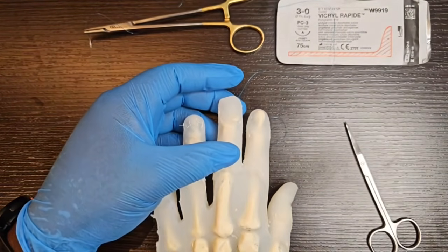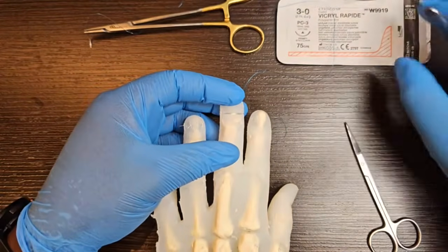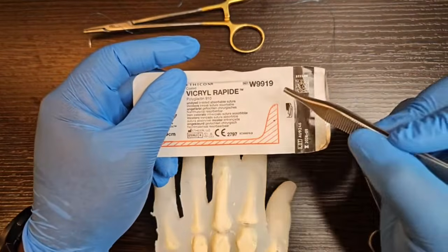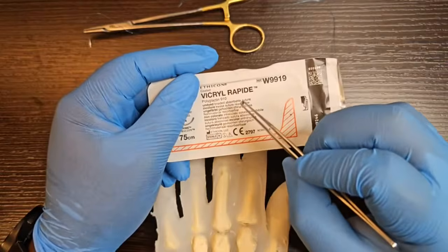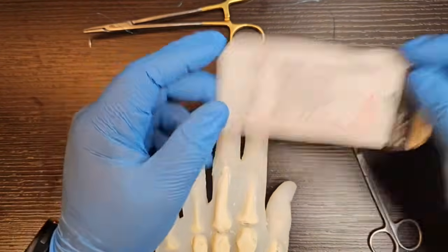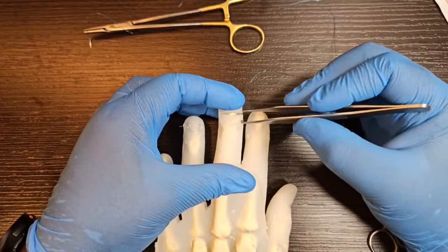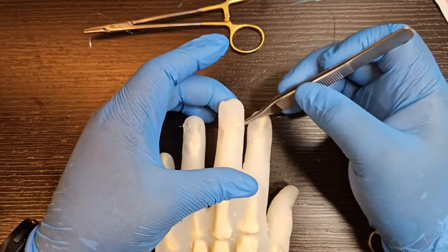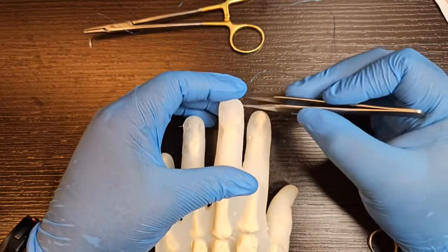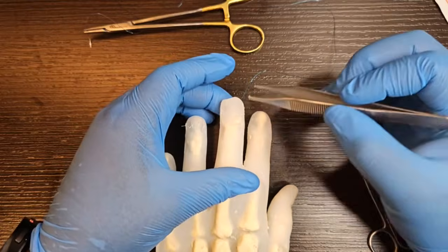Now we need to talk about how you're going to do your nail bed repair. So you need to select your sutures. I would typically use a dissolvable suture, a 5-0 Vicryl Rapide. If the wound is under a lot of tension, I might repair the pulp tissue with a non-dissolvable suture, or if I'm thinking it's high risk of infection, but I always do the nail bed itself with a dissolvable suture.